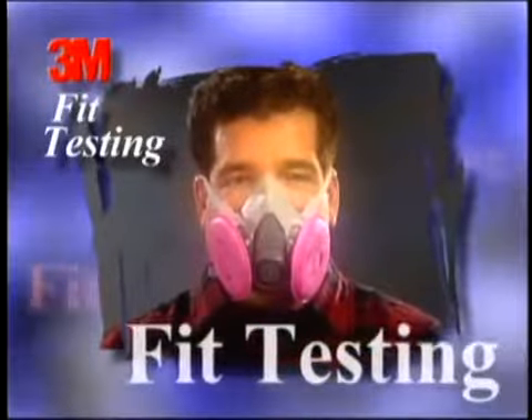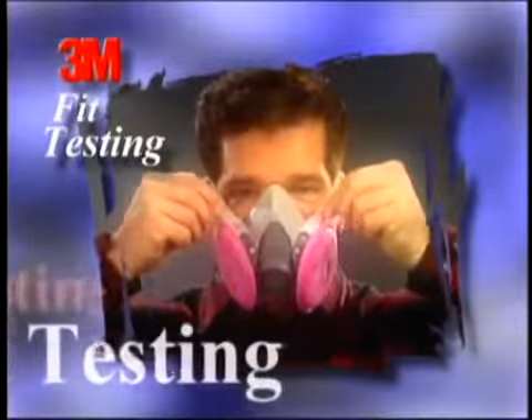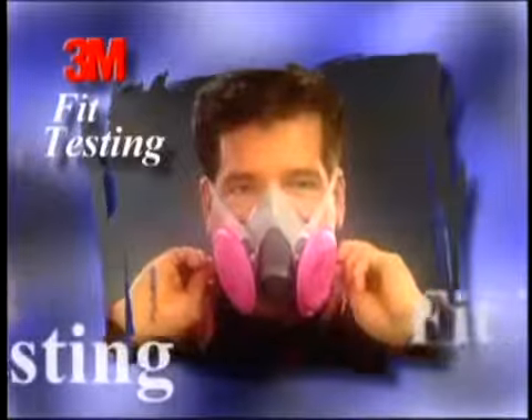When you are first issued a respirator and have learned to put it on correctly, you must make sure your respirator fits properly. Prior to being fit tested in any respirator, you must have completed a medical evaluation which determines your fitness for wearing a respirator.